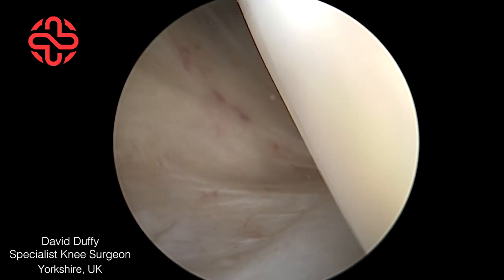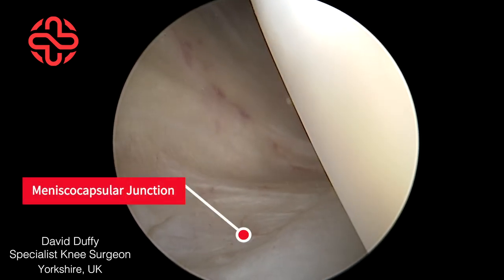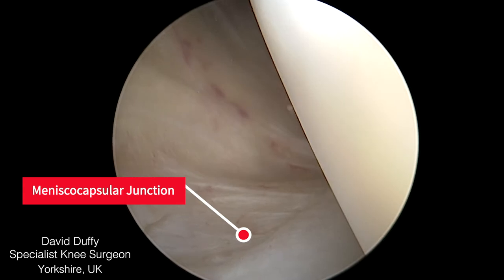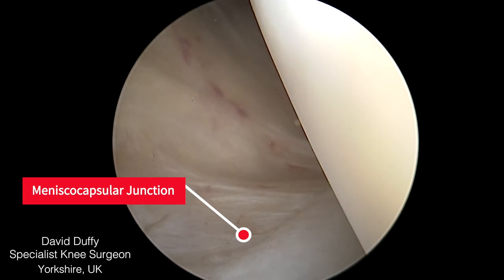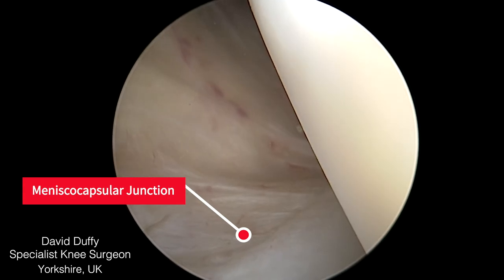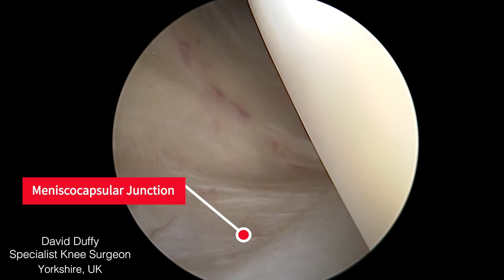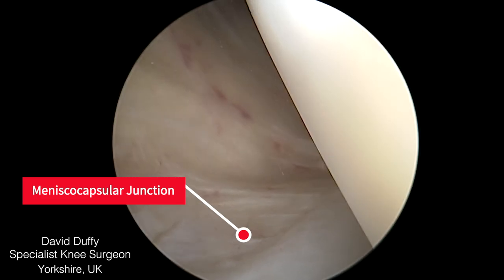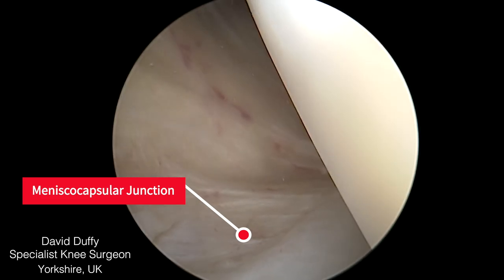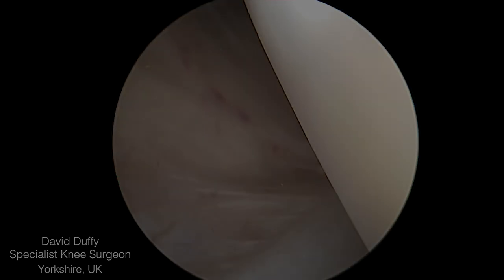In this normal knee the meniscocapsular junction can be identified. A ramp lesion, which is a longitudinal tear at this point, is often difficult to identify arthroscopically from the anterior compartment alone.